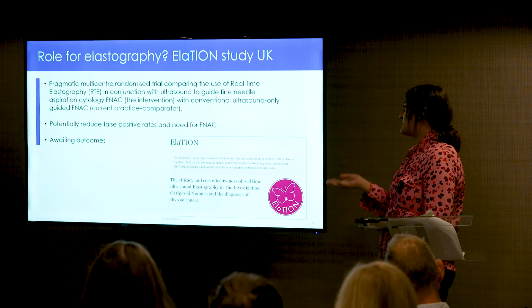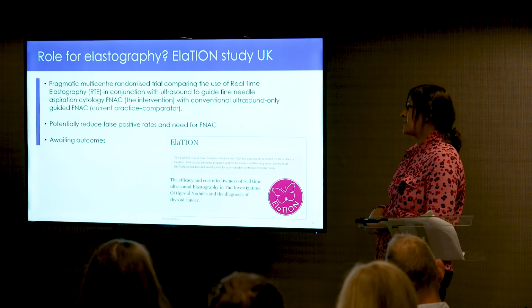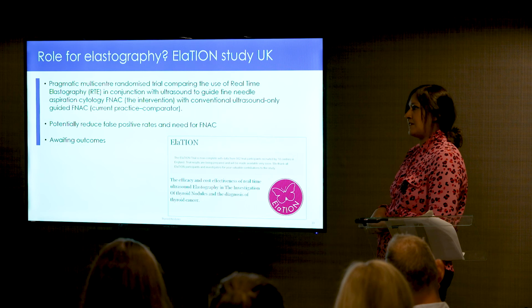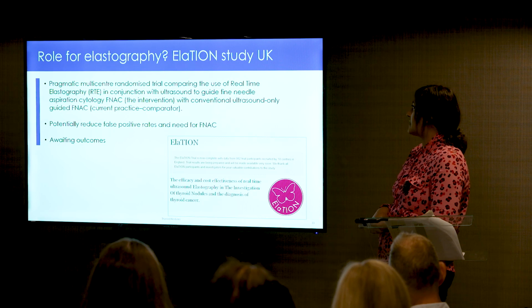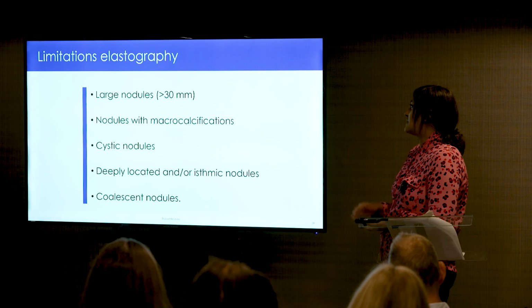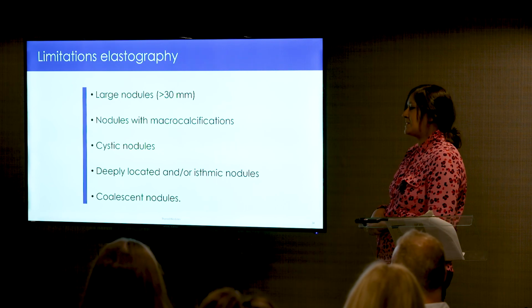And this is just a summary showing that there was an ELATION trial looking at the use of elastography. However, there are no clear outcomes or recommendations yet. I believe we are still awaiting that, but just to make you aware that this was a study conducted across the UK. So the final slide on elastography: there are multiple limitations.